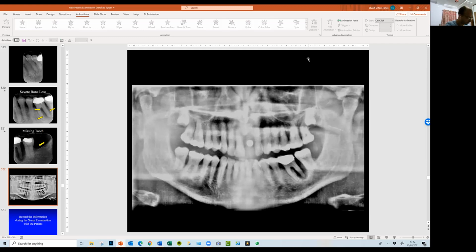Look again at that premolar, the upper right first premolar. Do you see how we know there's no tooth decay there, because we can see there's no tooth decay on that bite wing x-ray? So you have to be careful about that. Now you'll see why you take complete mouth x-rays. The other question is, why not? If you're doing a thorough evaluation and the patient is going to spend a reasonable amount of money on the implant, I'll show you the reason.